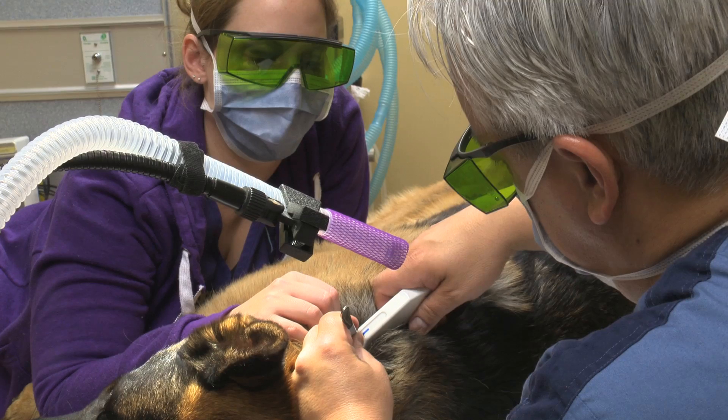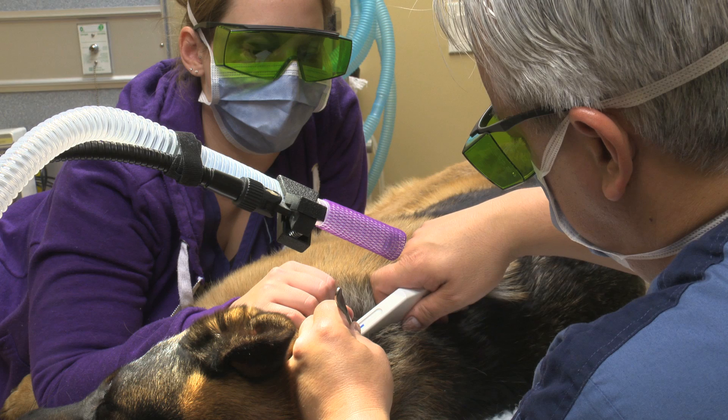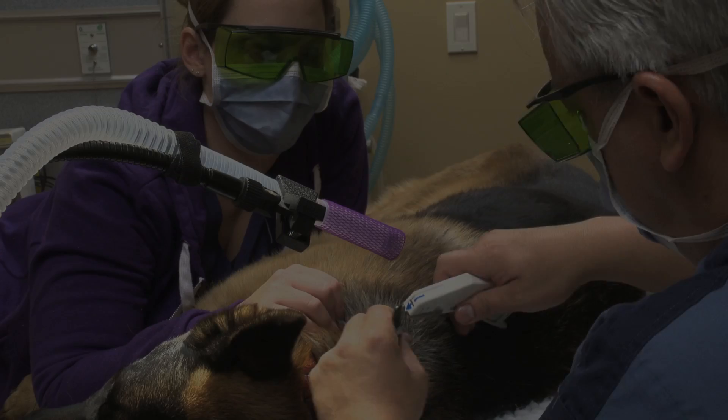So that looks pretty good. And then what we'll do is we'll just close it with some staples. The base of the laser, as you can see.